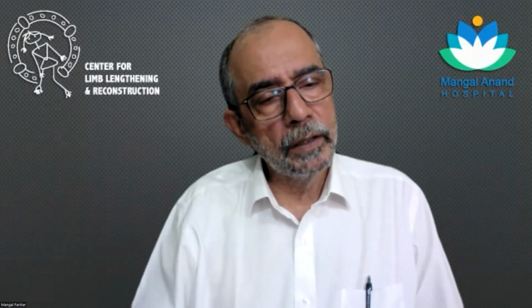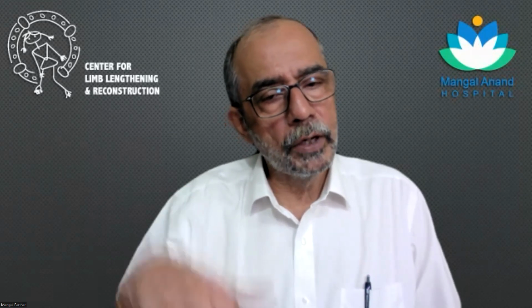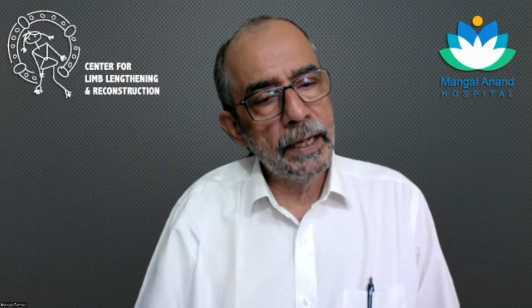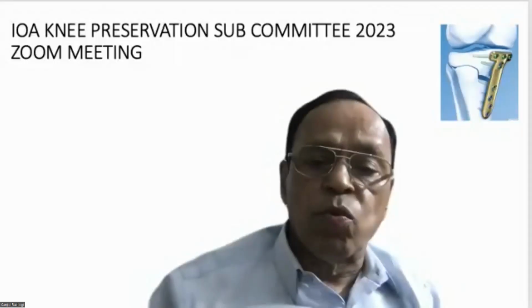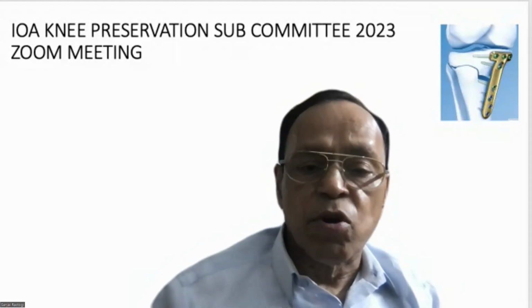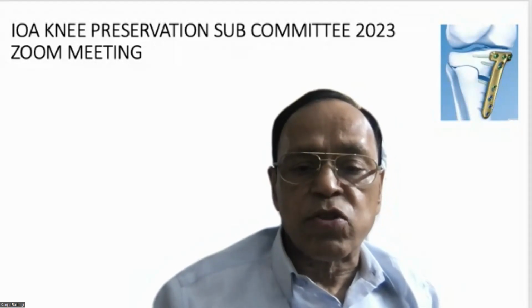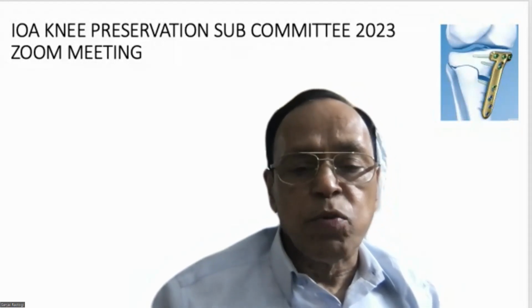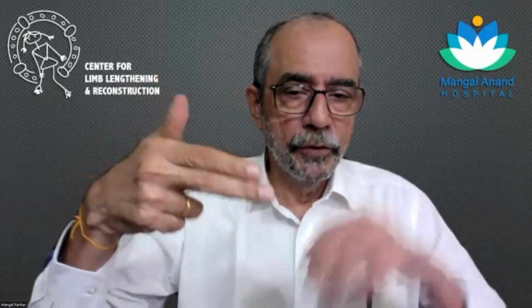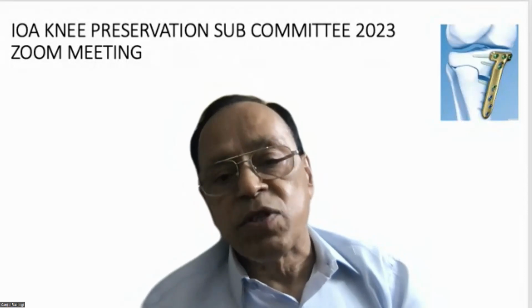So proximally I am straight onto the bone, because I've put in my periosteum, I've put in my hohmanns, and all of those structures are behind. Distally, I have the pes and the MCL. The way I would understand is, if you raise the popliteus from the posterior border, then that will protect the neurovascular structures, and you can put the plate on the MCL. Yes, but Sanjay, to get to the popliteus, you have to go anterior to the MCL, no? That means from the anterior edge, posterior to the MCL. Posterior to MCL.